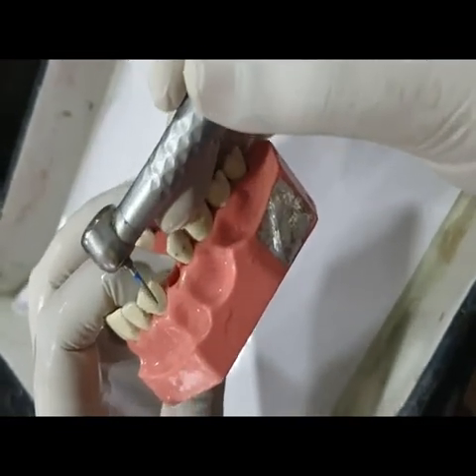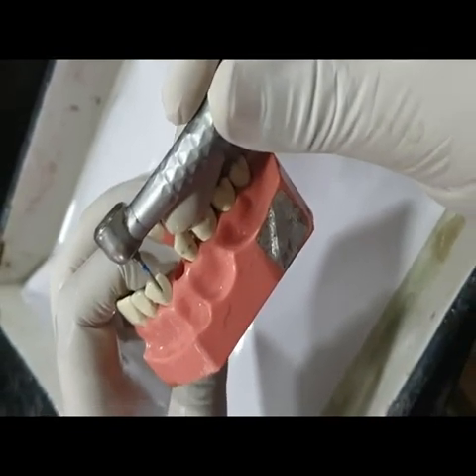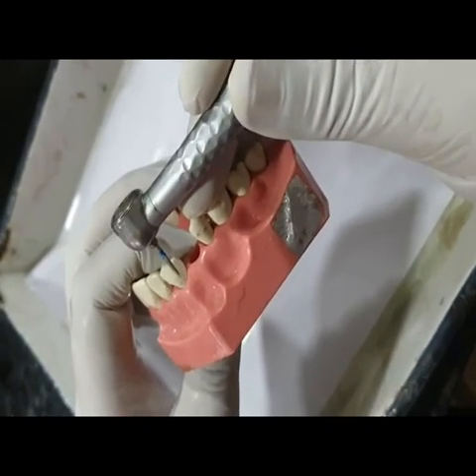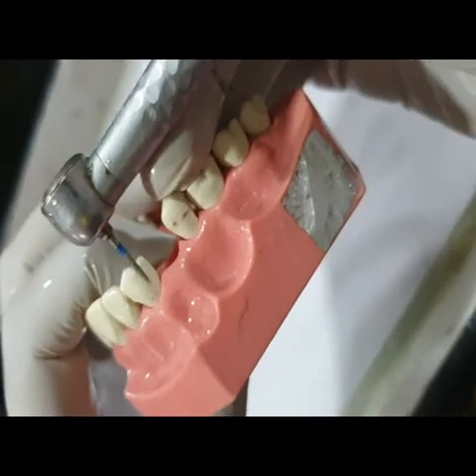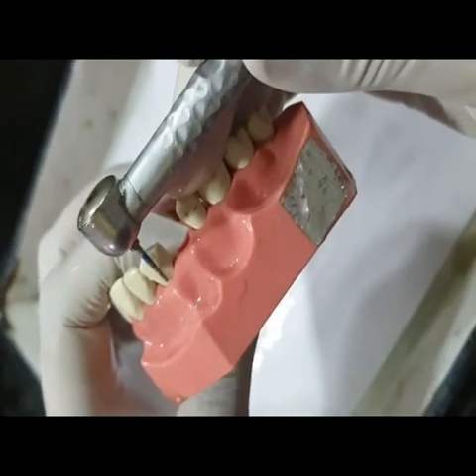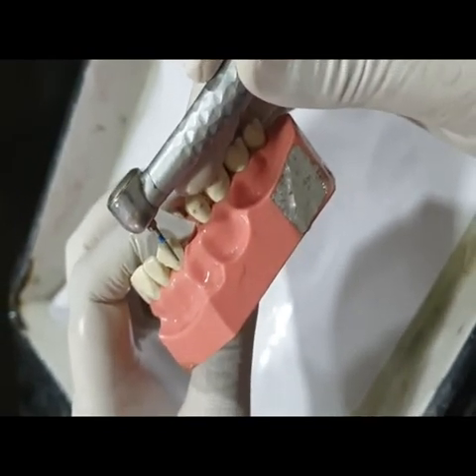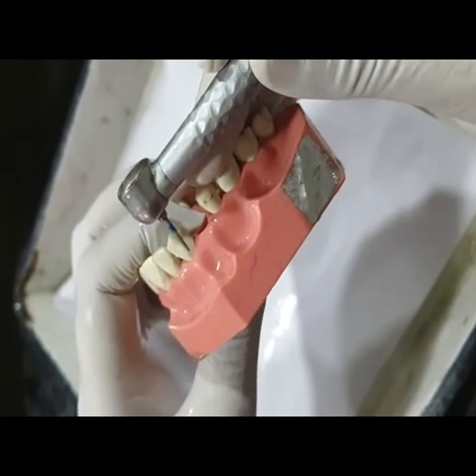Now we are dividing the labial surface and doing the labial reduction in two halves: incisal two-third and cervical one-third. These two reductions have to be done in different planes so that in the end we get a curved labial surface as is present in the natural tooth.